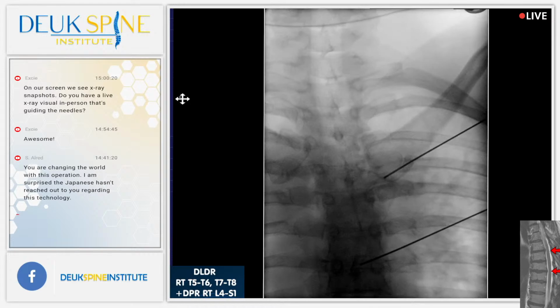See that? There's some kind of a growth there. Yeah, that whole thing. It's something very unusual. I mean, let's go back, yeah. But you don't see it at the other levels, it's just there. Let's go down, back to a lateral view.